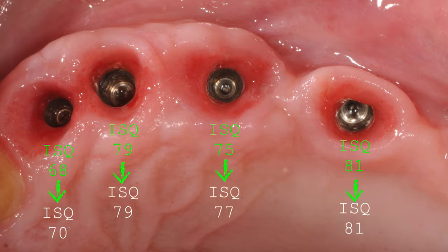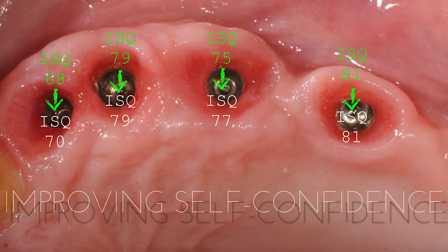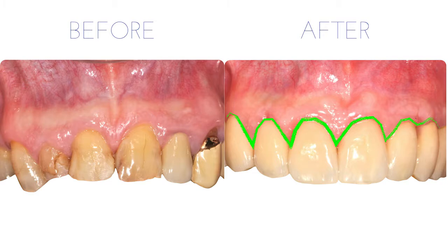But this time, it gives me even more confidence because I see that ISQ measurements are stable where I did my GBR procedures. And the one on the mesial is increasing up to 70. And this is very important because when we're treating these advanced cases, I would like to have an objective measurement telling me if I'm on the right track or not, telling me if I have to wait a little bit longer or not. And we cannot generalize, we cannot follow just general protocols. These are just unique cases. And this is the final result.